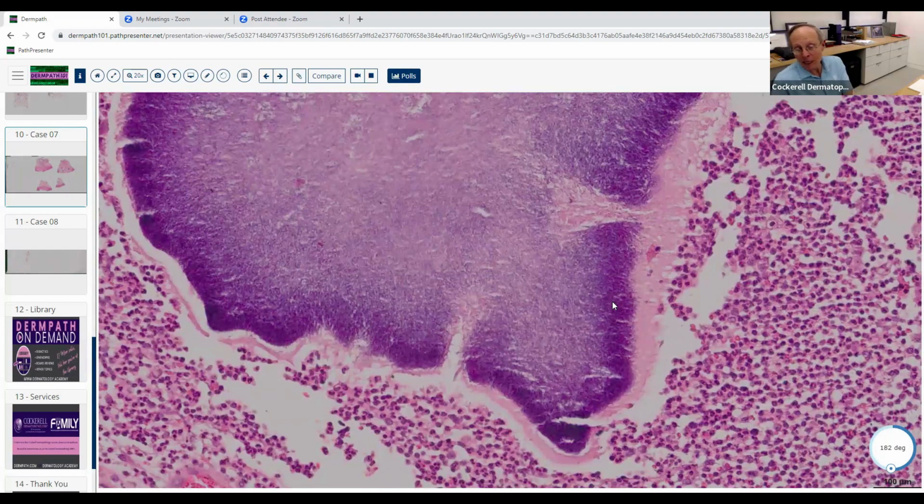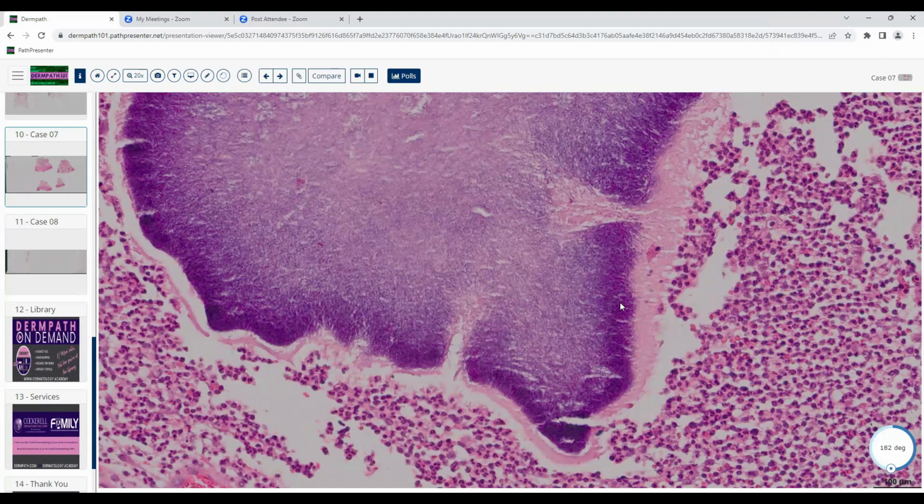You sometimes have to think, well, what's the difference in diagnosis of color changes in the skin? Like we talked about clear earlier in the eccrine lesion, that's glycogen. So here we've got purple, and you're saying, well, it's calcium. Is it possible it's not calcium? Yeah, it could be kind of like an infectious agent. Okay, what's like an infectious agent?